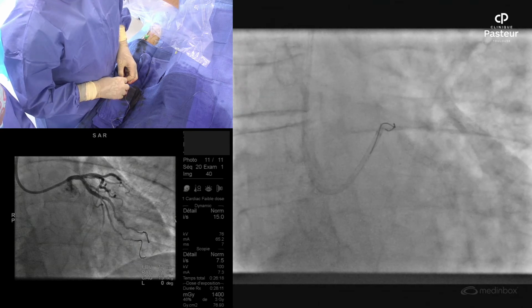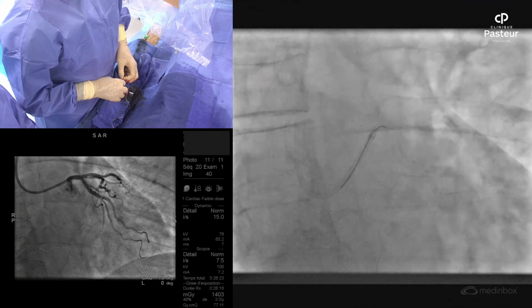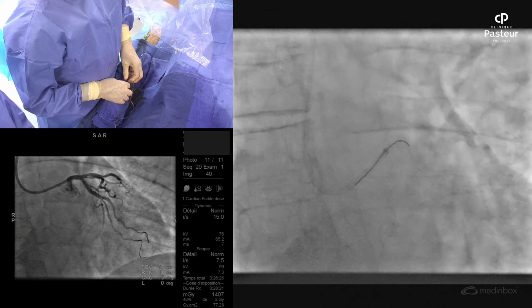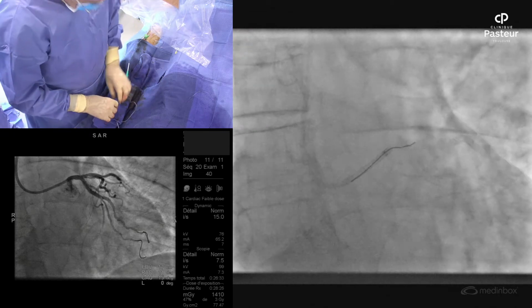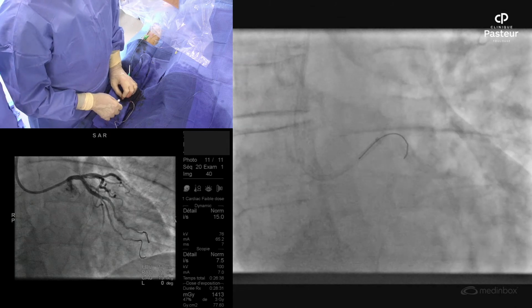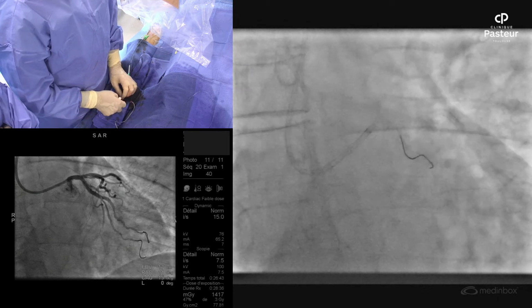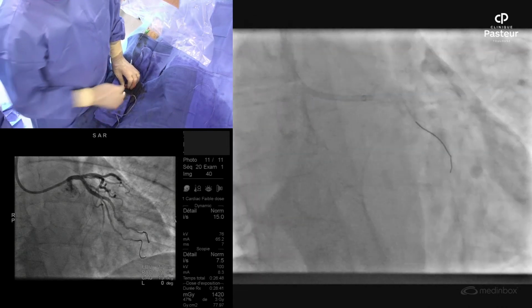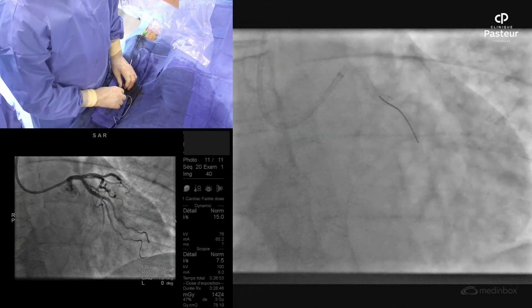Now, interesting because. Okay. Sorry, it was open. Maybe you don't need the injection. I give you the torque. We can see the stent of the OM. Okay, it's not too bad. Now what we need is to place. Now this is not the right one. You are in the distal one. It's the second one. Yeah.